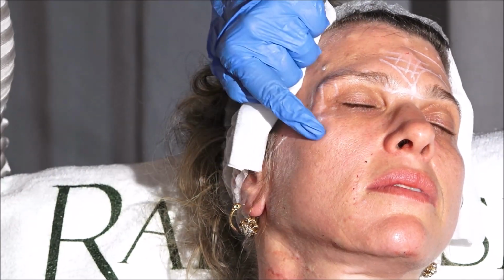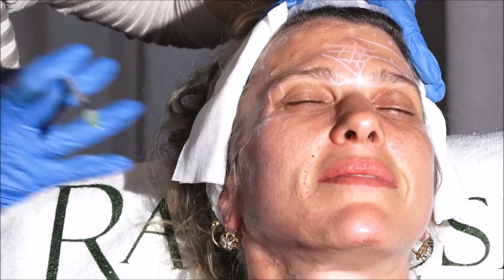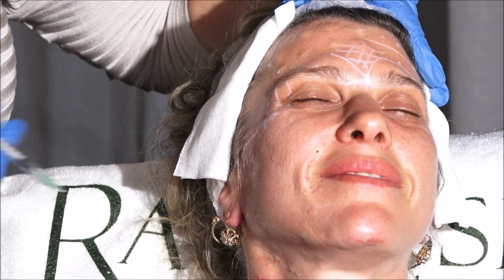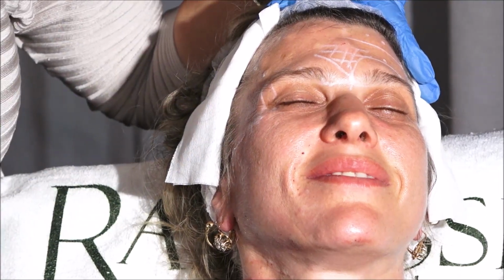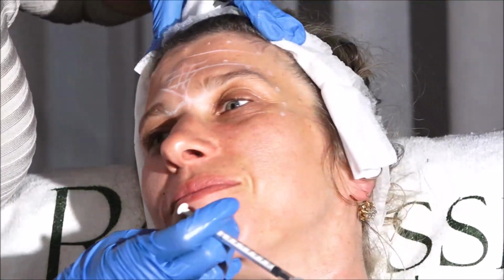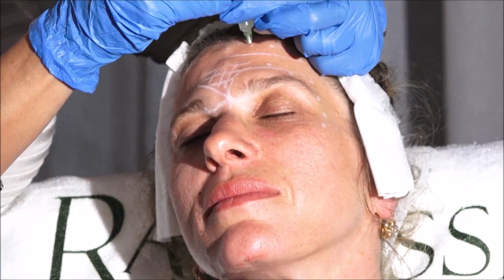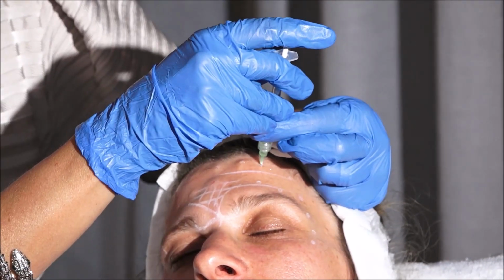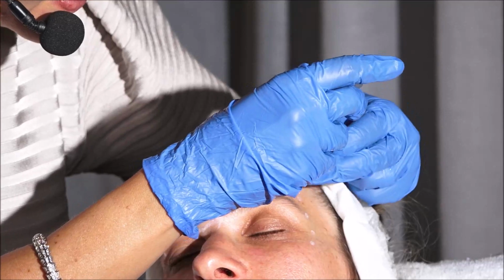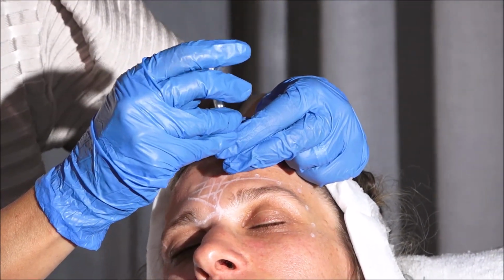You don't see when she smiles how many wrinkles she has? Smile? Another inside. No, radial. Here, I don't have to block. If I block here, it's enough. No? Yeah. Two units. 1.